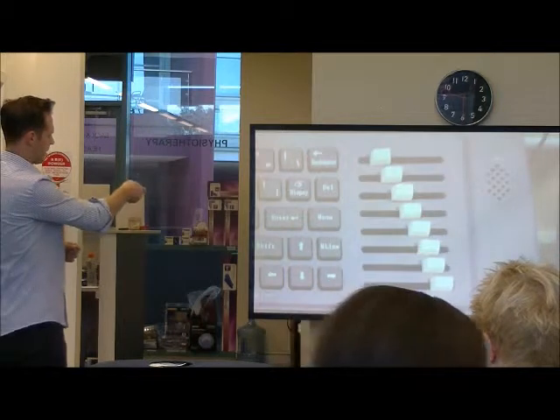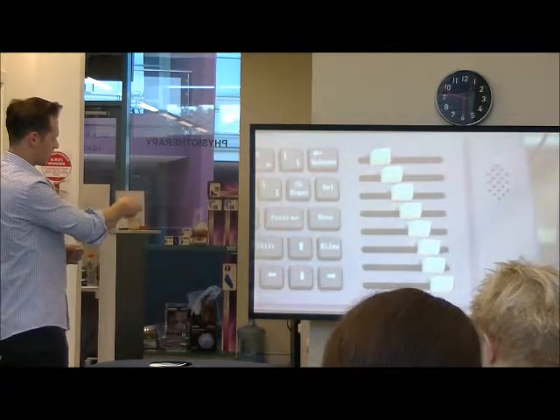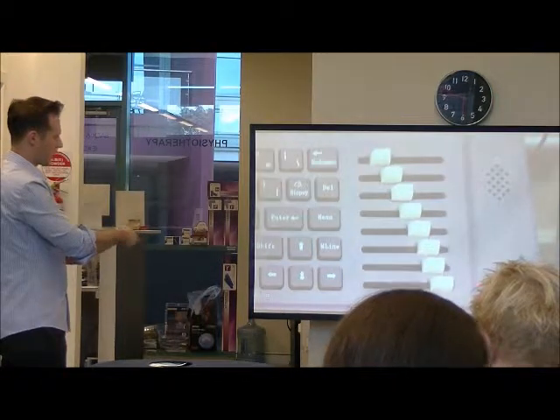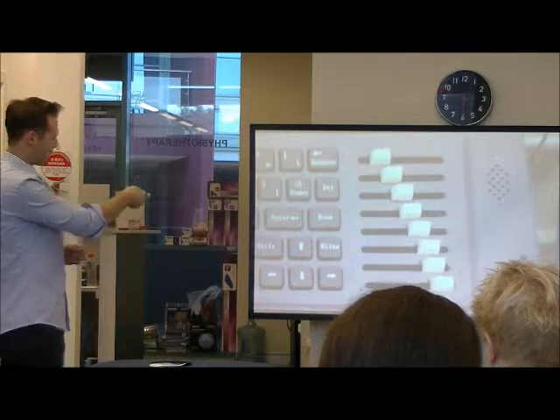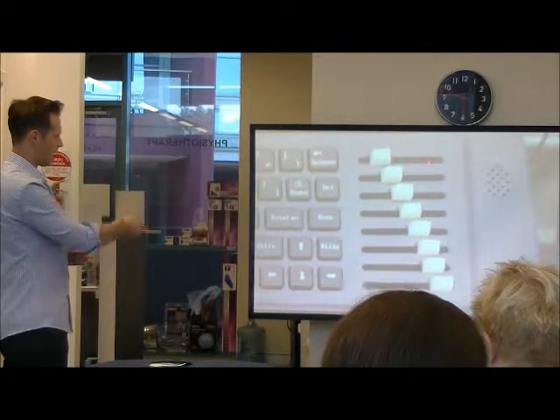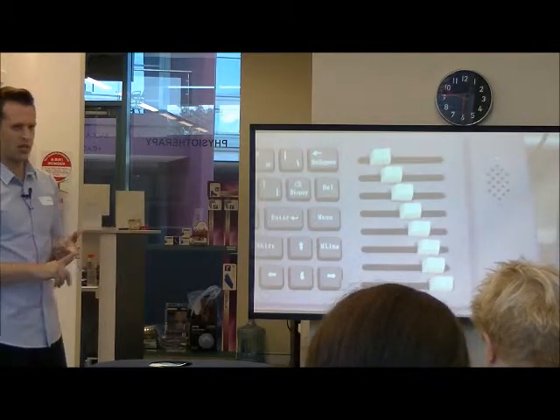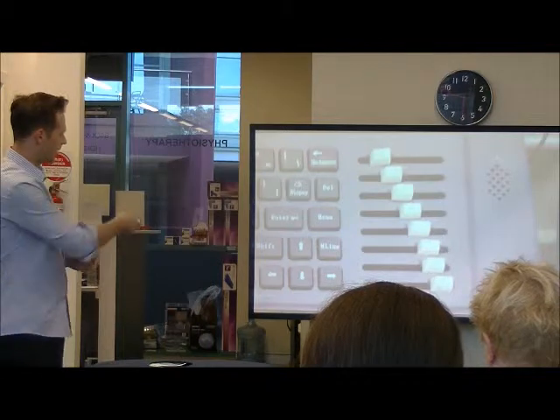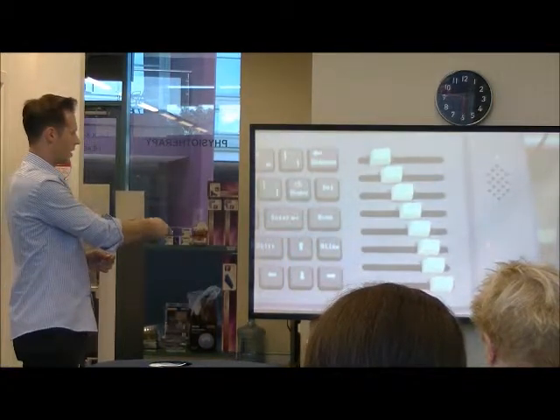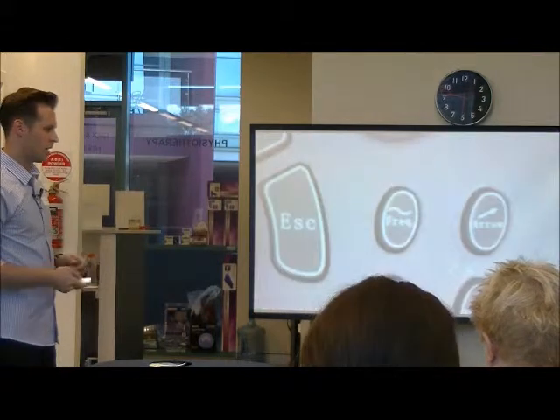Now, these knobs are called time gain compensation or time gain control. And you see how they're basically lined up. This is the superficial structures, this is the deep structures. What this does is it increases the amplitude again of the echoes at the level of that particular bar. So again, important to know, because attenuation means that the sound waves coming from deeper are going to be washed out or are going to be weaker. And if we can turn up the intensity of the lower areas of the image, it's going to help us to get a nice, even, clear image.